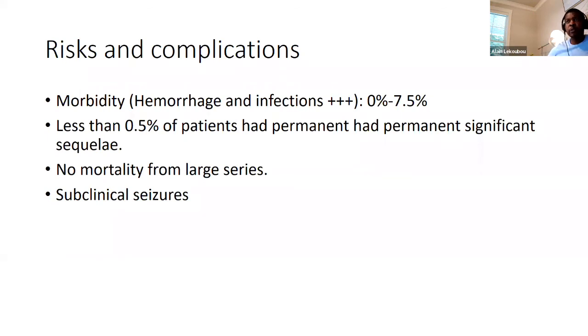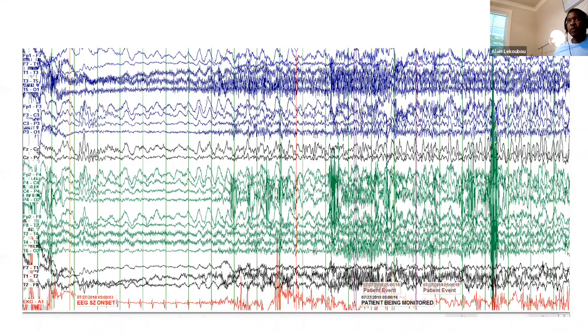Now let me just show you two slides to conclude. One is the surface EEG. This is what the patient's surface EEG looks like. This is what you see when you do the regular EEG, the one that you do every day, and it looks like this. It's really just a jumble of lines. If you ask where the seizure is coming from, the left side, which is here, or the right side here, we don't know.